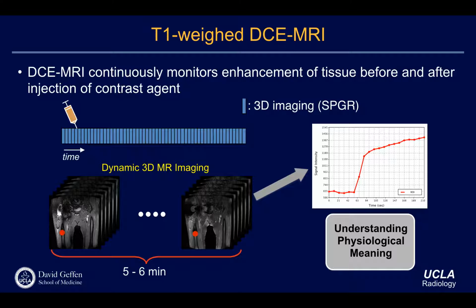And then the question is, can you quantify that kind of signal behavior and then use it for tumor characterization and detection? For different sites, will they have a different time delay? Why do you think so? I just think the perfusion rate is different in different tissue. Okay, so maybe. Yeah, there are some differences, but normally the differences are subtle compared to the temporal resolution, but there is definitely a little bit of local difference.